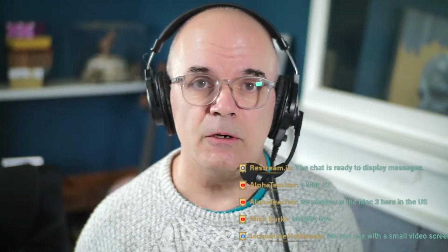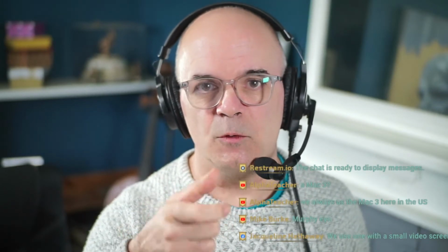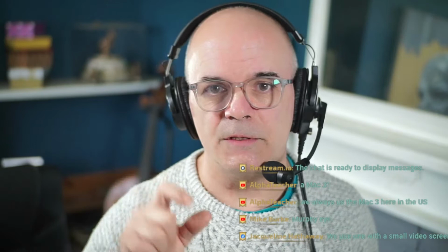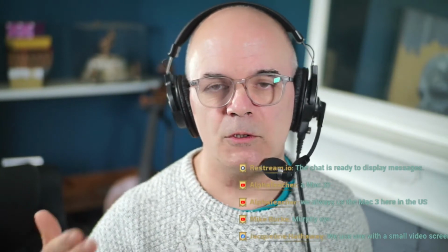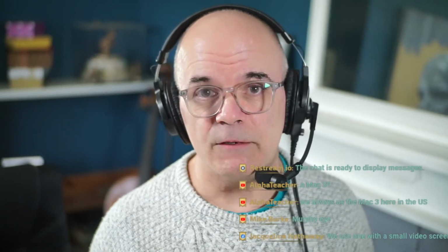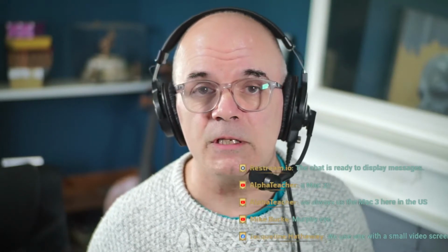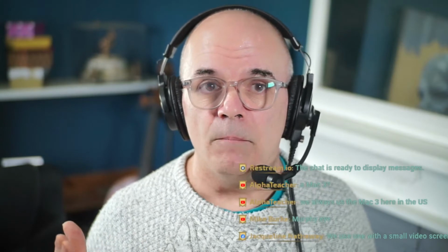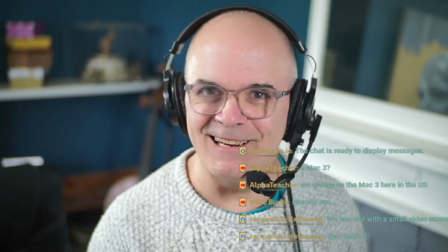Yes, Jacqueline, one with a small video screen. I suspect you're using the McGrath then, and I love the McGrath. It's a lovely handle. It's got disposable plastic blades on it with a tiny little screen off to the side. More often than not these days, we will almost always have video laryngoscopy to one side if we don't use it first. If we think we're going to have problems with the airway, we'll use the video laryngoscope first. But often we will almost always have it ready and handy. Yes, Jacqueline, it's lovely, and if you've ever held it, it's really nice to hold as well.